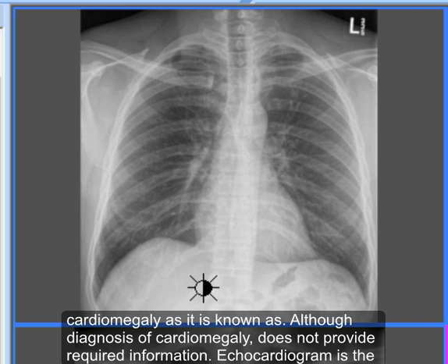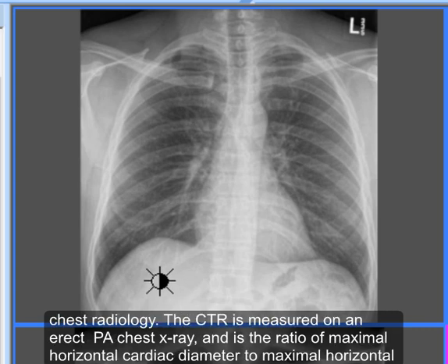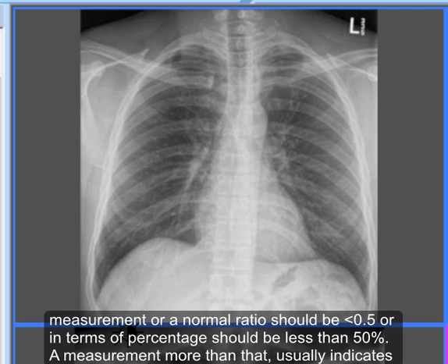Although diagnosis of cardiomegaly does not provide all required information, echocardiogram is the exam of choice. Having said that, measurement of the cardiothoracic ratio is a very standard practice worldwide in chest radiology. It is measured on an erect PA chest X-ray and is the ratio of maximal horizontal cardiac diameter to the maximal horizontal thoracic diameter. The transverse diameter of the heart should be less than half of the maximum internal thoracic diameter — a normal ratio should be less than 0.5, or less than 50%.